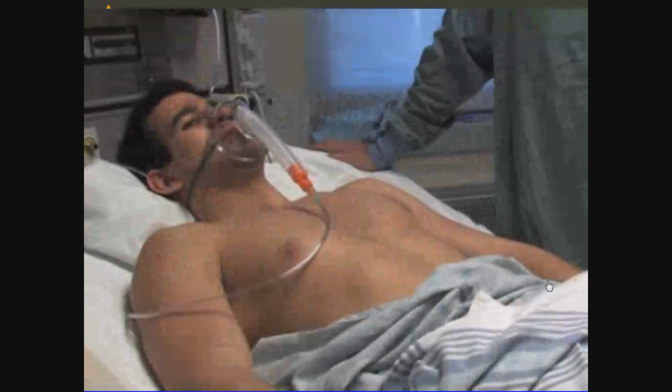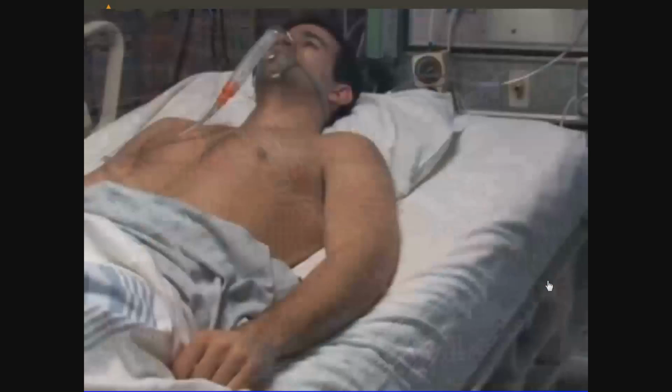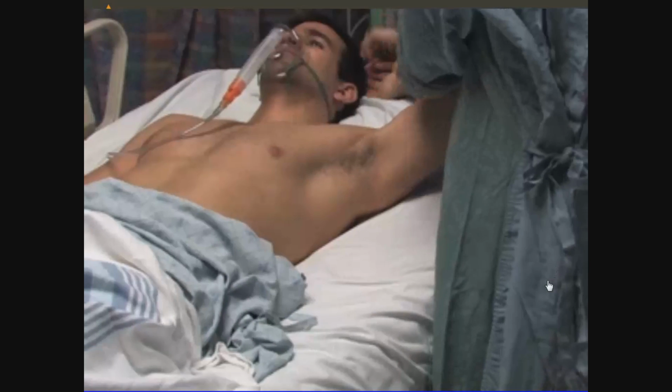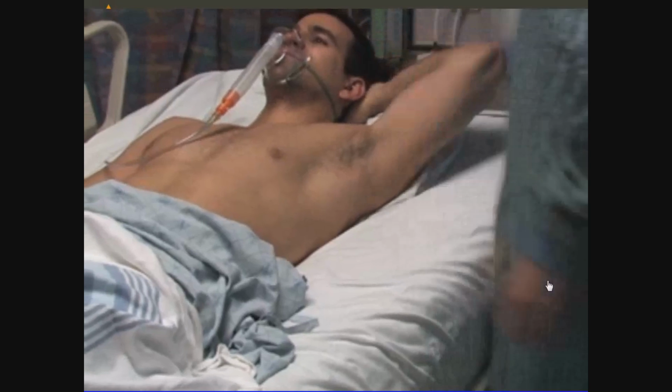The patient should be positioned either supine or in a semi-recumbent position. The ipsilateral arm may be maximally abducted to the side of the patient, or, alternatively, positioned behind the patient's head in order to have optimal exposure of the insertion site.